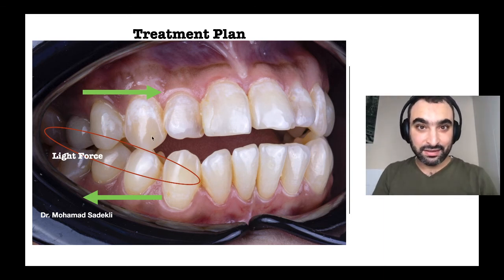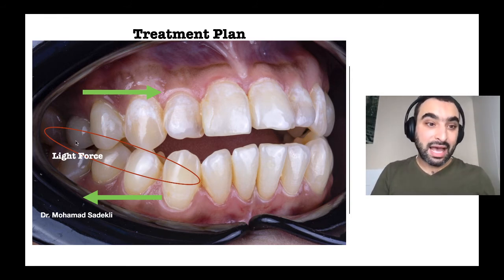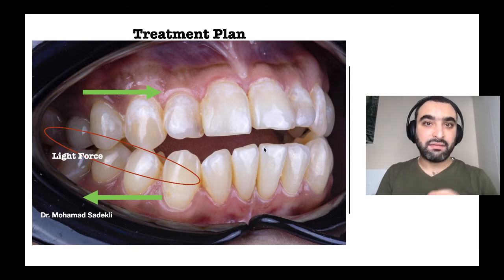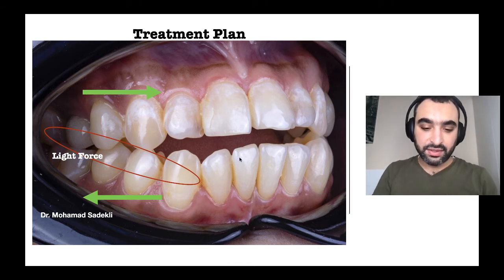So if I want to do expansion and use early intermaxillary elastics, okay, and I need full control of the teeth, which kind of brackets do I have to use? Self-ligating brackets, for this case with the intermaxillary elastics. For a case that really needs intermaxillary elastics, I need to have a self-ligating system, or passive self-ligating system, which is the Damon. So I used light forces from the second month of the treatment with the Damon system.